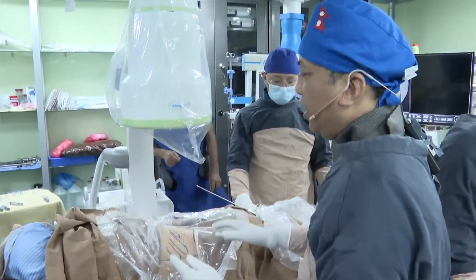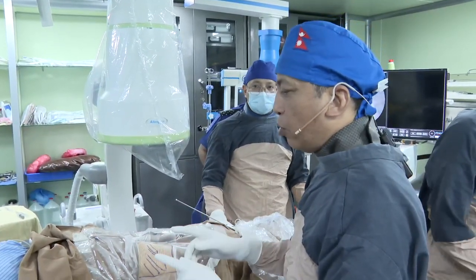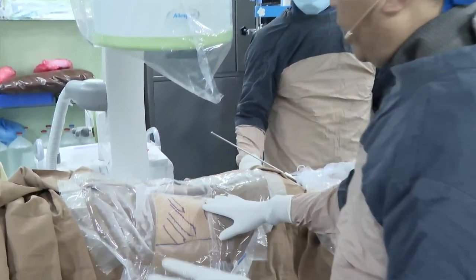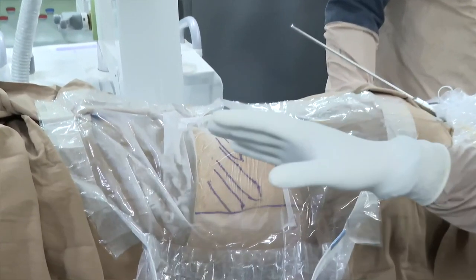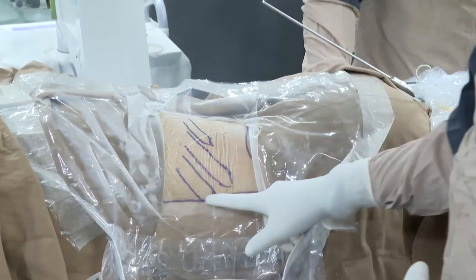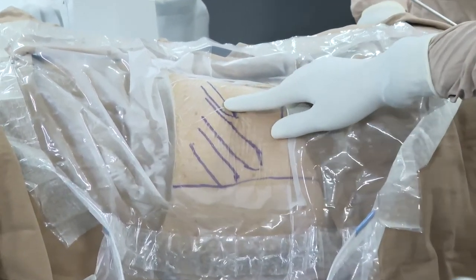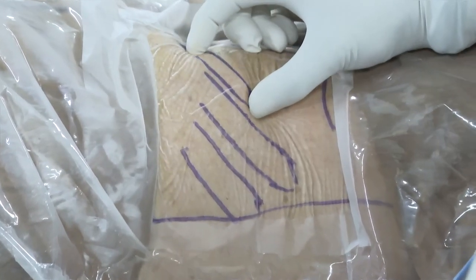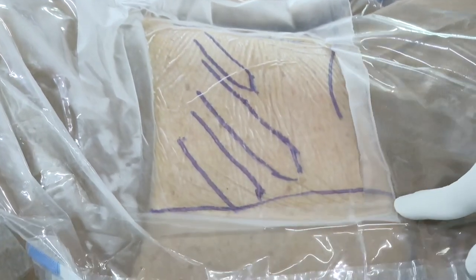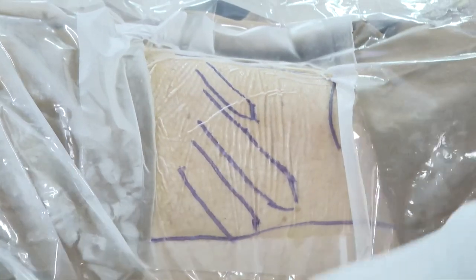In my regular practice, we perform mini PCNL under spinal anesthesia whether it's a small stone or a staghorn stone. For live demonstration purposes today we are doing this under general anesthesia. I prefer to do mini PCNL in the prone position because it has wide space to play. This patient has a very short 12th rib and long 11th rib — the puncture site is the posterior axillary line.